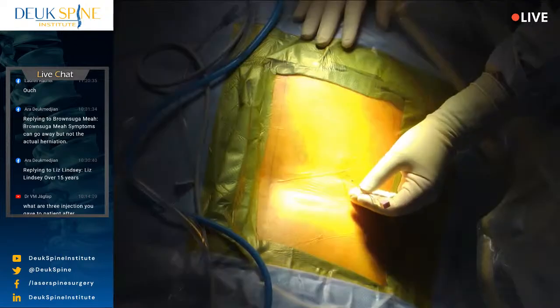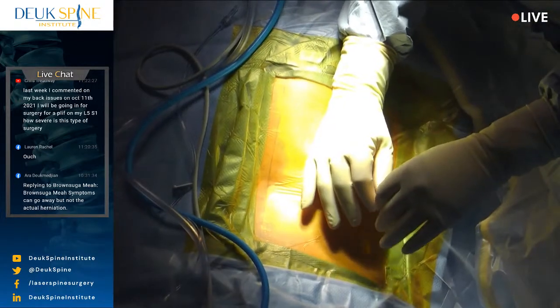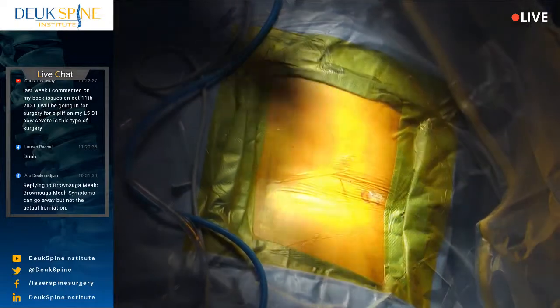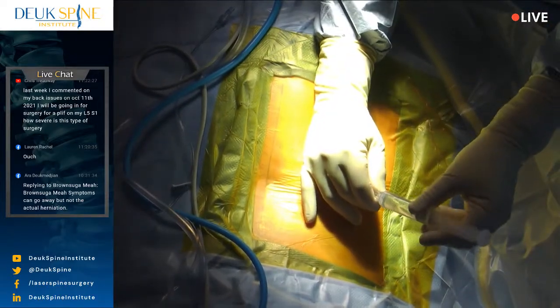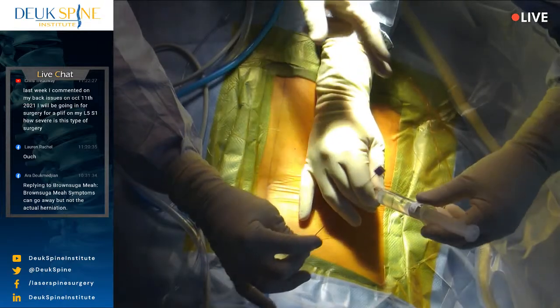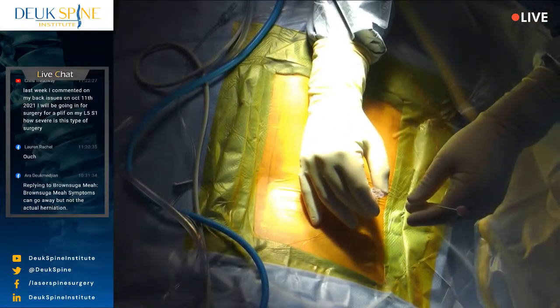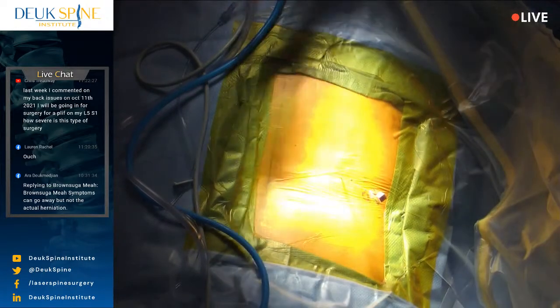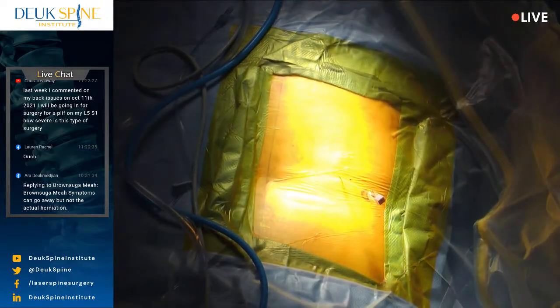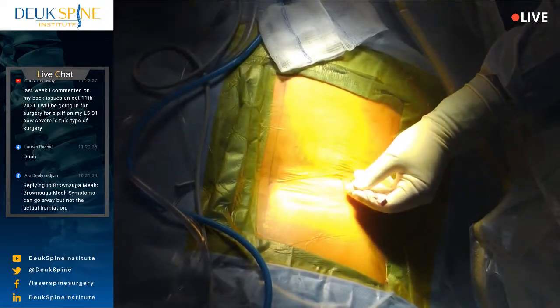You're doing fine, just relax. You want some more numbing medicine? Yeah? Just lay still. I don't want you moving. Okay, the deal is if you feel pain, you say ouch, but don't move around. All right, we can't have you moving. We do need you awake for just a few minutes, and then we'll put you to sleep, okay? My promise. I just have to safely get down to where your herniation is. No, just lay still.